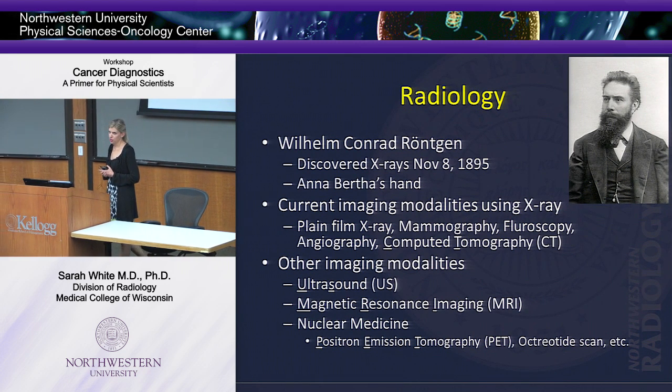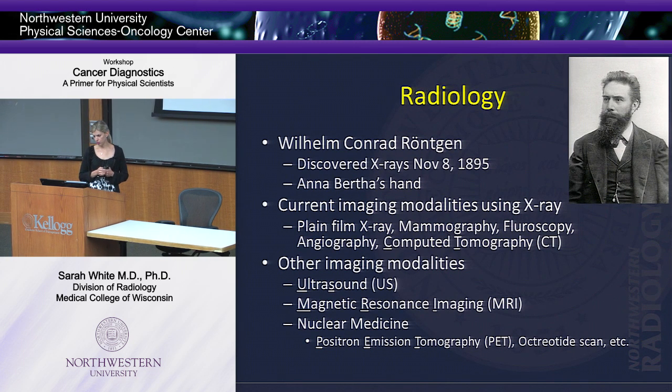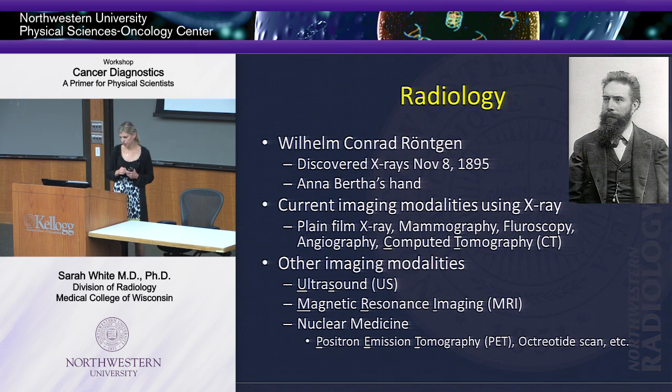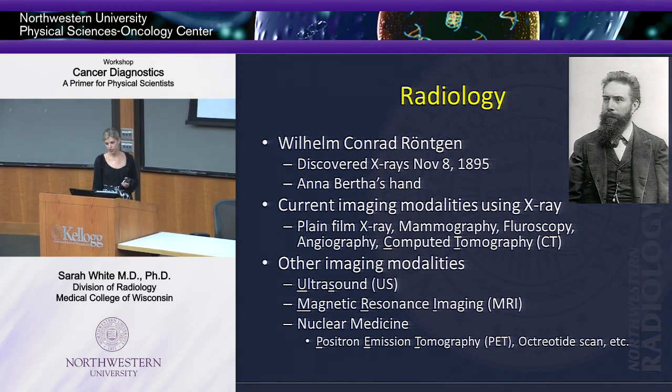Current imaging modalities we use: there's X-ray, which we attribute to Dr. Röntgen, and with X-ray we can do a lot of things. We can do mammography, fluoroscopy, angiography, and we'll get through what all of these are, and CT, computed tomography. Other modalities that have come down the pipeline are ultrasound, which we use every day, MRI, which I'm sure you've all heard about, and nuclear medicine, which has been around for a long time. I'm going to show you pictures and examples of each and every one of these.